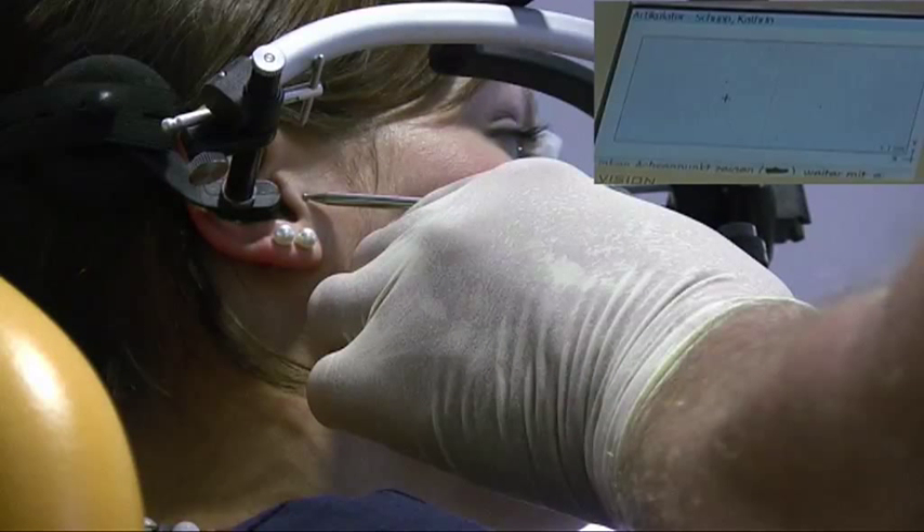The hereby displayed individual hinge axis can then be marked with a pen. Accordingly, this takes place also for the second axis point.